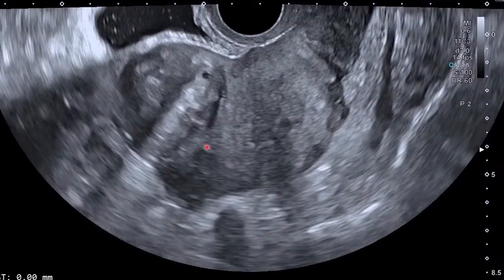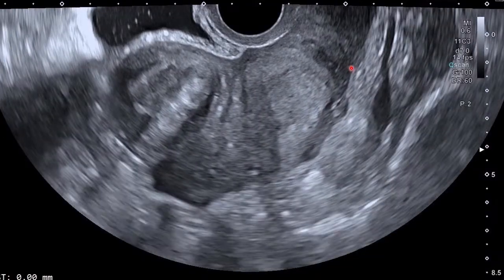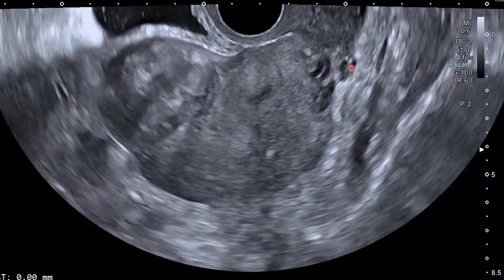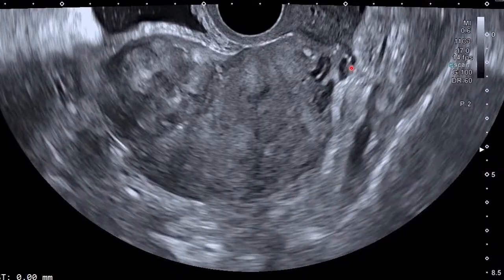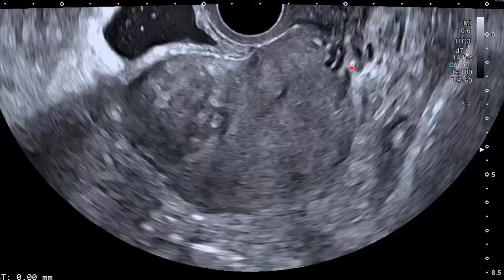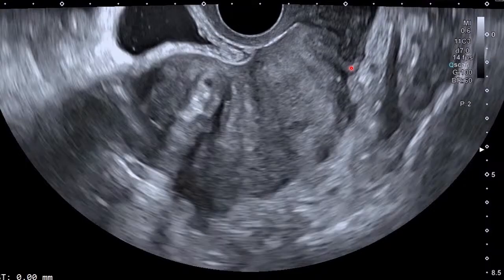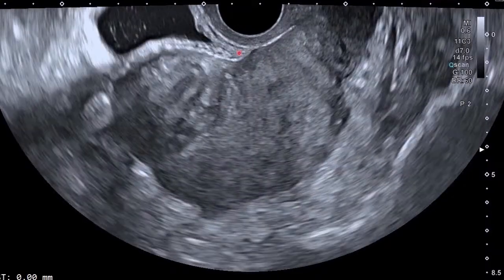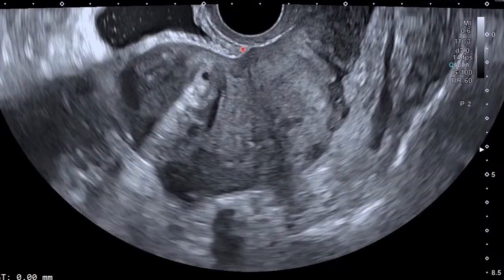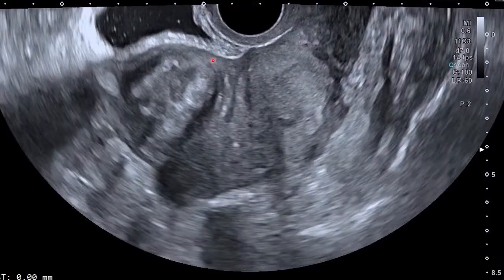Me, I'm still shocked. I am very much shocked by what that thing is. But let me say my thinking in this case, I am thinking of a hydatid cyst. A vaginal hydatid cyst is very rare, but the morphology of that mass has the morphology of an echinococcus cyst, a hydatid cyst, the cyst structure that you've seen there. That's my line of thinking, that this is a vaginal echinococcus cyst, but it's a very rare finding, if not one of its own.